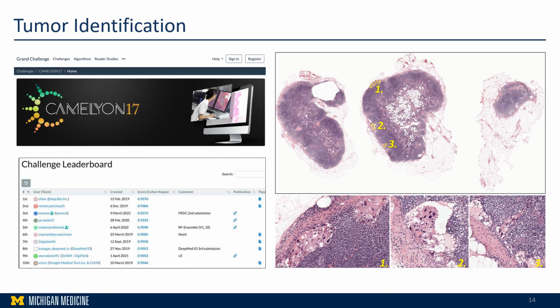Among its initiatives, Grand Challenges have focused on leveraging deep learning algorithms for the automated detection of metastatic breast carcinoma in whole slide images. By providing identical datasets to all participants, these challenges attract groups from various organizations and institutions, enabling fair comparison of tissue segmentation modules that ultimately facilitate lymph node classification.